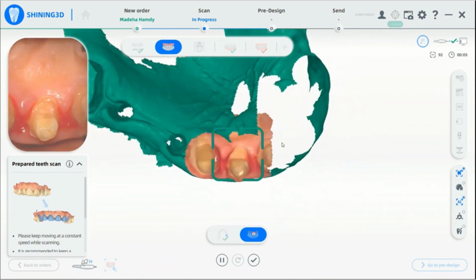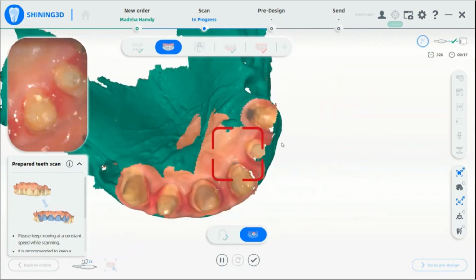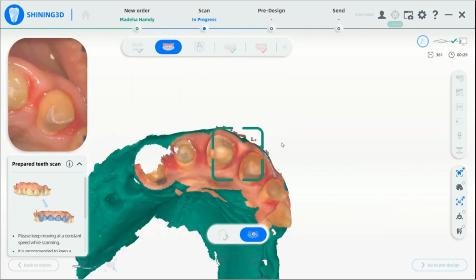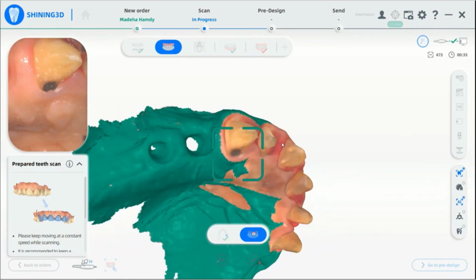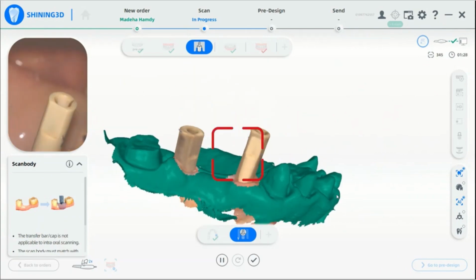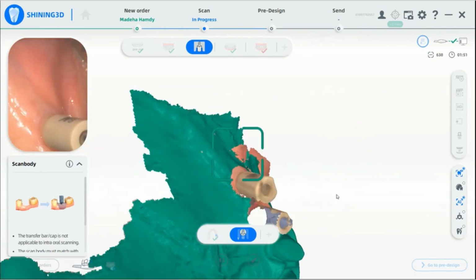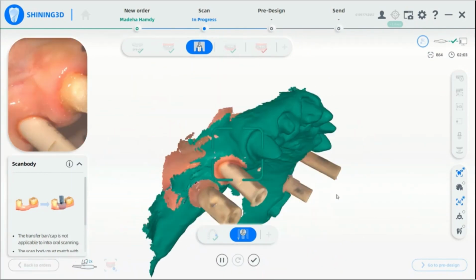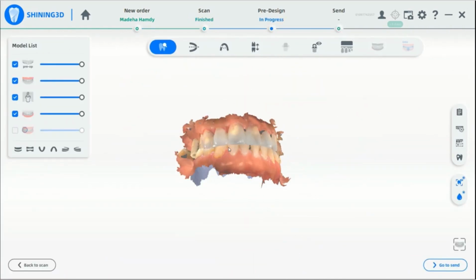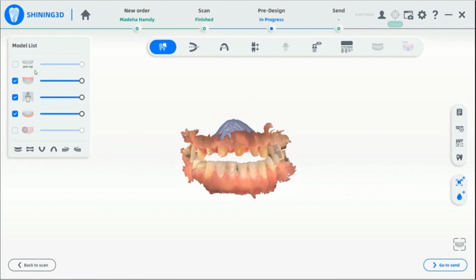Now, after preparation of the anterior teeth, you scan, and the software in a very easy manner will align both scans, the pre-operative scan, which preserves the bite, and the jaw scan after preparation, in one total jaw. Here is scanning of the scan bodies in a very smooth workflow, and finish of the case. So we preserve the bite and scan the prepared tooth, and at the same time scan the implant with the scan body scan technique.